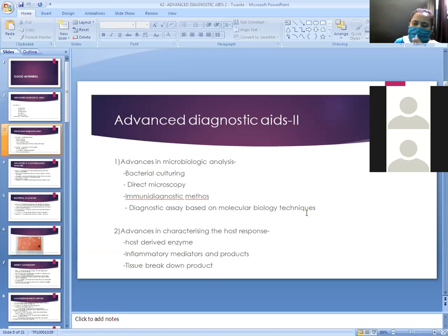So on the basis of clinical features, the proforma which you use while recording case history. So periodontal status clinically you check. For diagnosis of periodontitis, you check periodontal probing pocket depth. Then you check mobility of that particular tooth. You check clinical attachment loss, right? And when you treat, you remove plaque, calculus, and again the patient comes. So how are you going to evaluate?